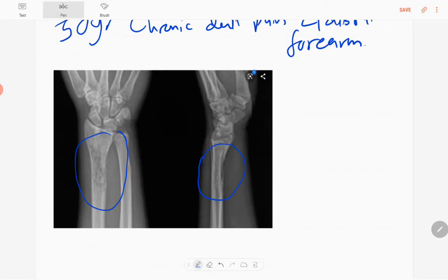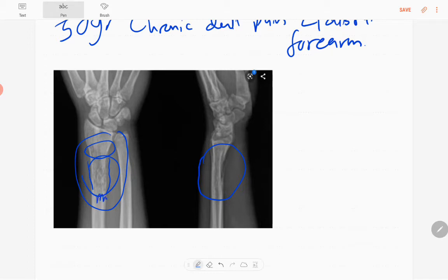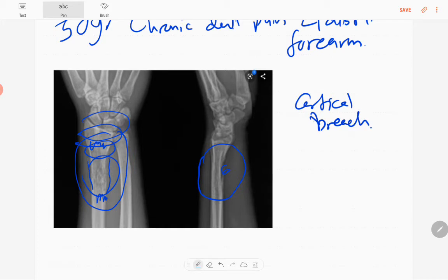There is a lytic pattern of lucency in the left distal radius with involvement of the metaphysis and metadiaphyseal regions. There is slight expansion of the bone. The wrist joint is normal. There is a wide zone of transition, which is an aggressive feature, and cortical breach is also present.